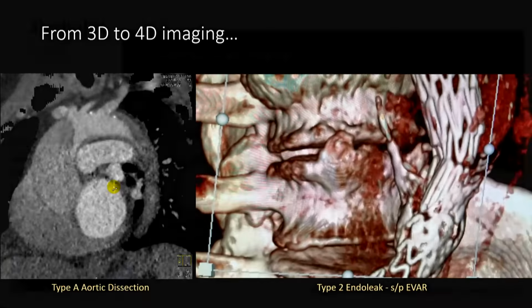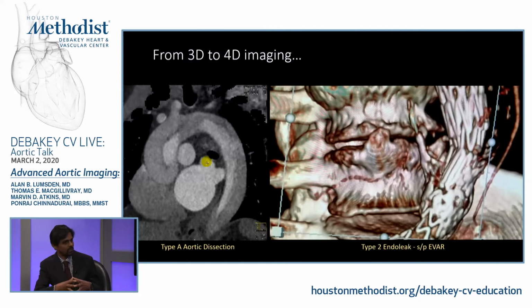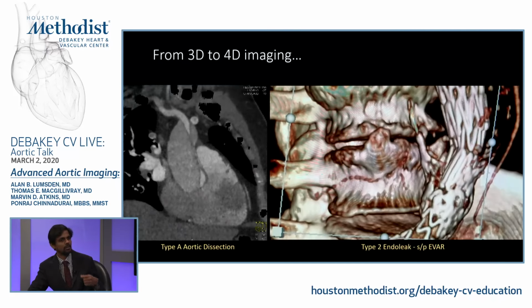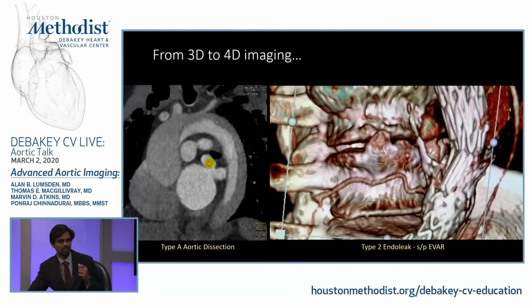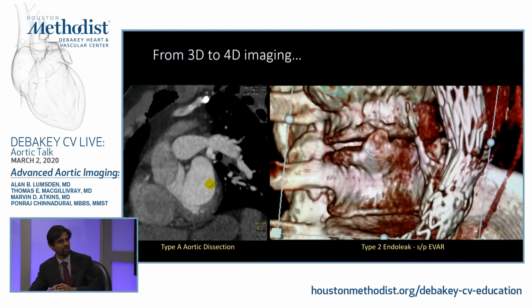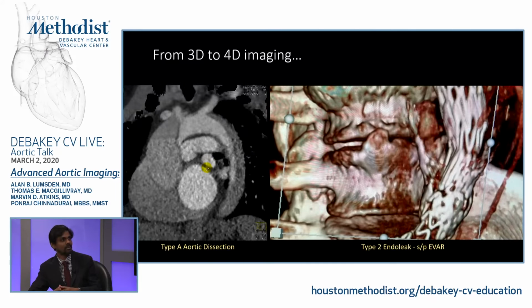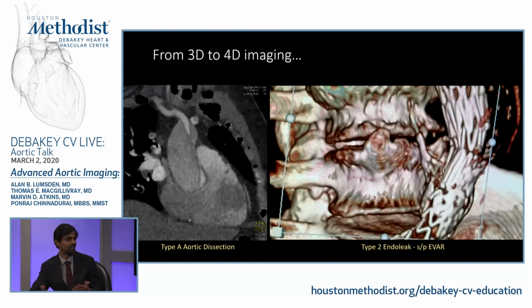So in my opinion, the diagnostic imaging is still best from CT or MR, and we shouldn't be using our precious OR time to make the diagnosis. Most patients who get a CT image or an MR image, the protocols have to be optimized enough to understand the underlying clinical question that the surgeon or the interventionalist is looking for, and then when we take the patient to the OR, we are in this phase of executing our plan, right? Most often where we spend a lot of time in the OR is trying to find the diagnosis, especially in endoleak cases where most people get inside the sac and we are shooting multiple pictures, selective angiograms, and then trying to see where it is filling.